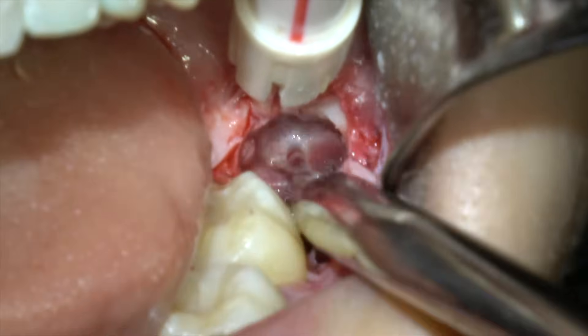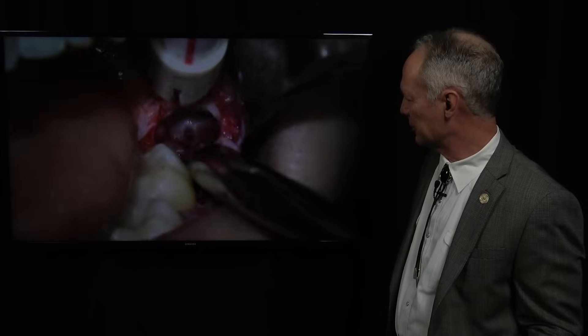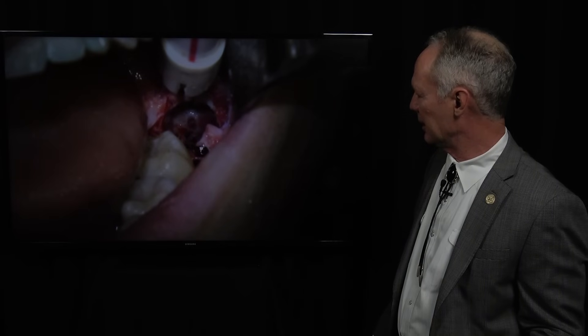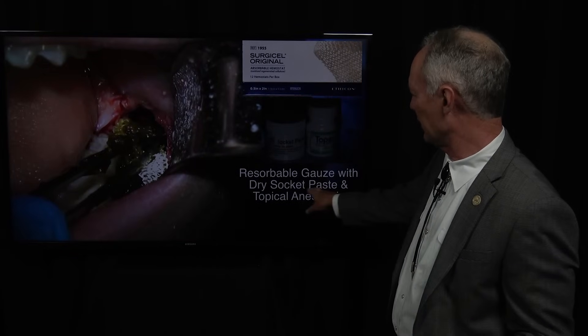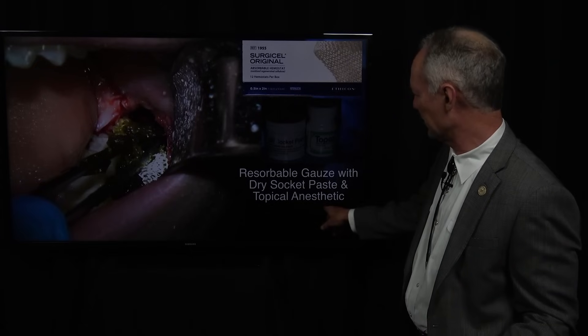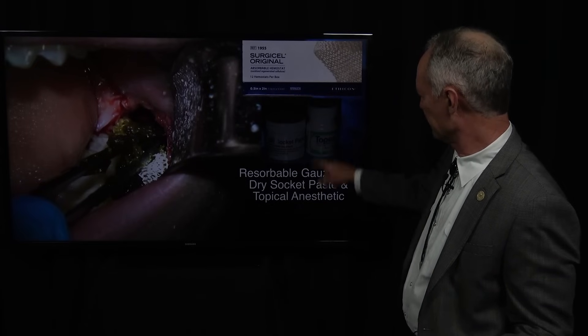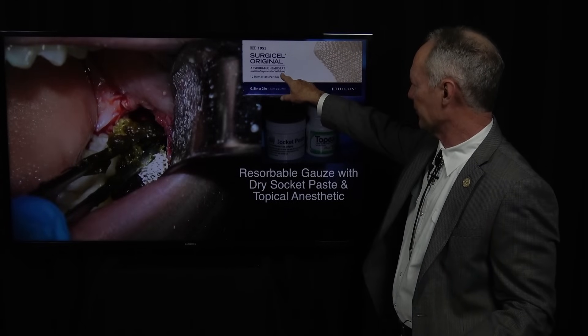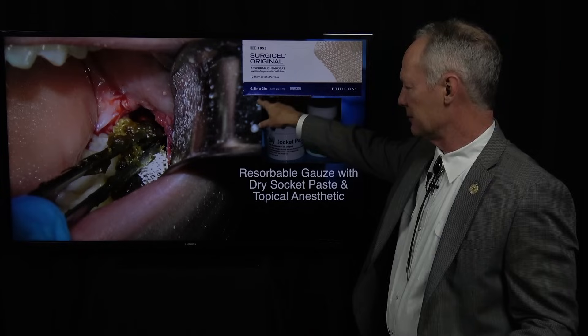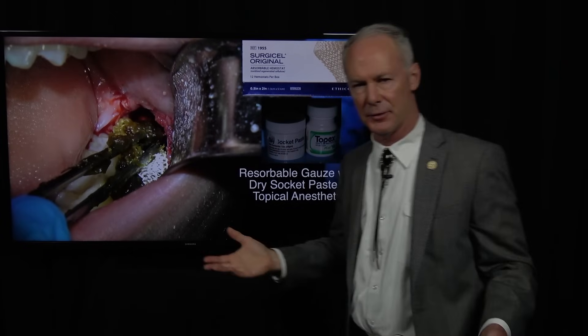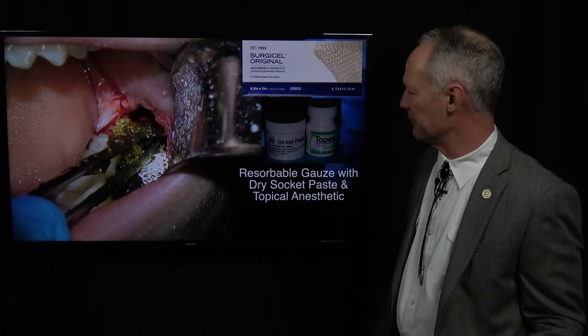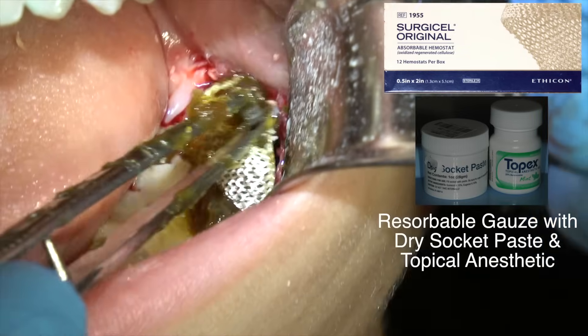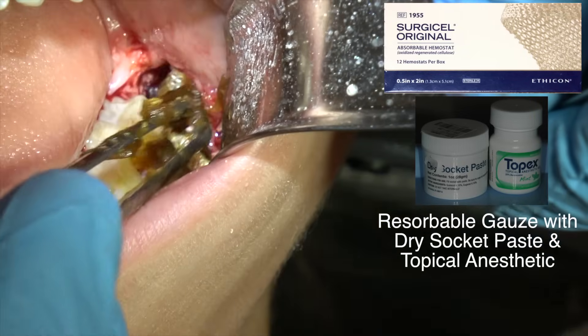Now you're going to irrigate the socket so that any remaining small pieces come out. And then we're going to pack it with resorbable gauze with dry socket paste and topical anesthetic. This is socket paste and Topex topical anesthetic. This is Surgicel absorbable gauze. I'm going to put the paste on the gauze. Now I always do this if I've had to cut bone. I always pack the socket if I've had to cut bone.